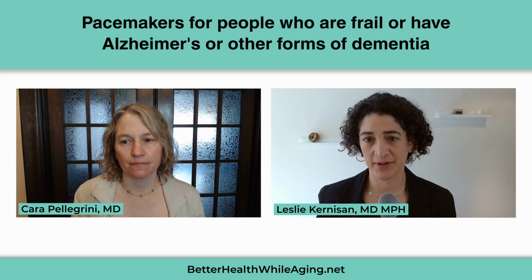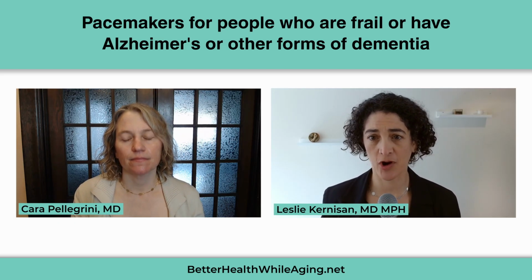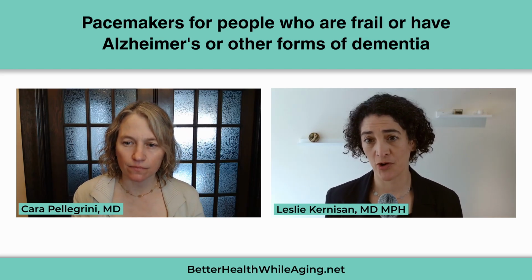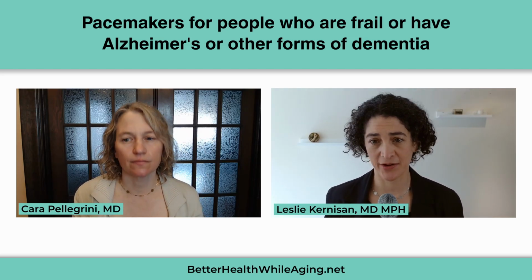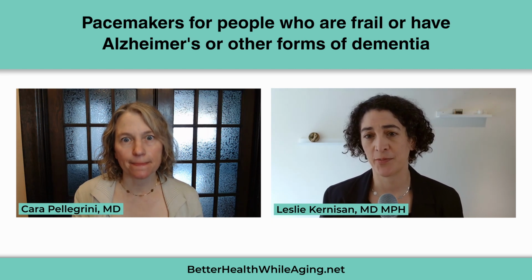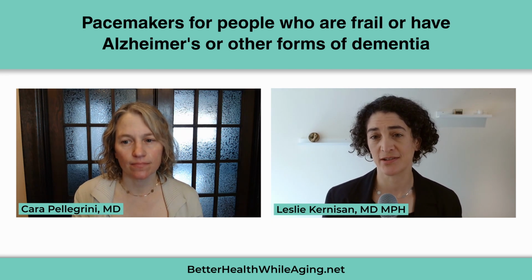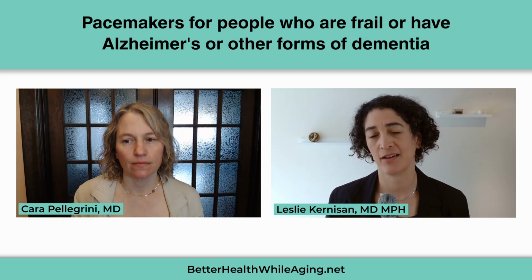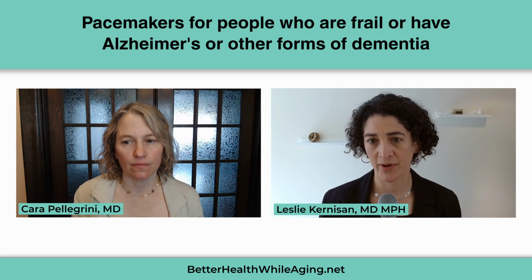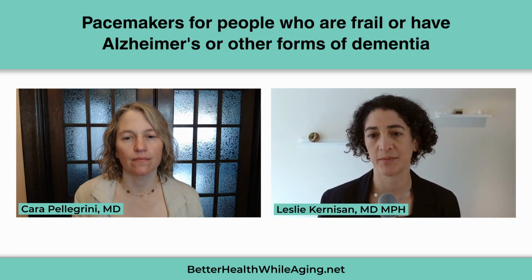Well, it sounds like if somebody is experiencing bradycardia, a slow heart rate that is giving them symptoms, this is something where when we put it in, they really can feel more energy, their mobility can be better, their ability to participate in life can be a lot better, and that it's normally a pretty simple, straightforward procedure. So even if somebody has Alzheimer's or memory problems or is quite up there in years, they could really benefit, especially if their heart rate has been low enough to be giving them significant symptoms.